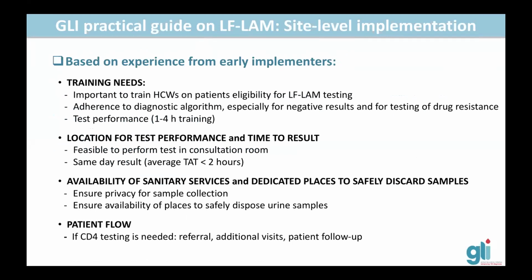In terms of training needs, it's really important to involve both lab as well as clinical personnel. It's important to be very clear on the eligibility for lateral flow LAM testing, and the adherence to the diagnostic algorithm, especially for negative results and for testing for drug resistance.